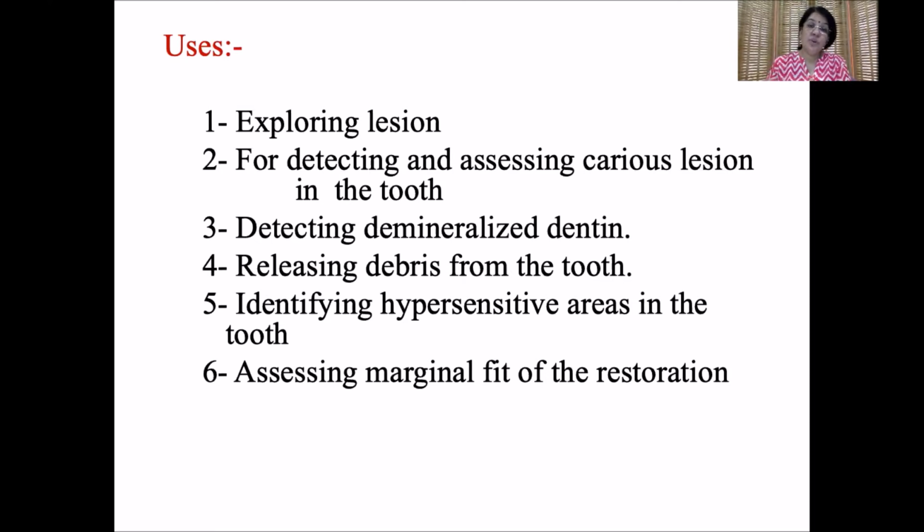Okay. So you have seen this, all your teachers do. Whenever you go with the silver amalgam completed cavity, the teacher moves the probe along from the tooth surface to the restoration. What are they trying to see? They are trying to see whether your probe will stop in between. See, if you have a trackpad, I think most of you must be on the laptop.